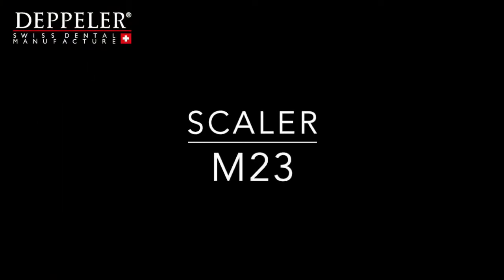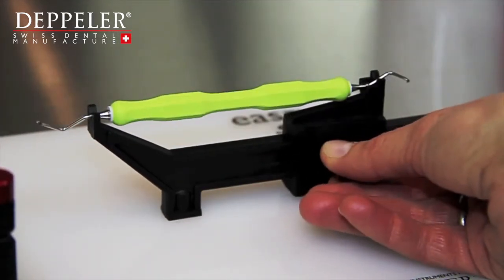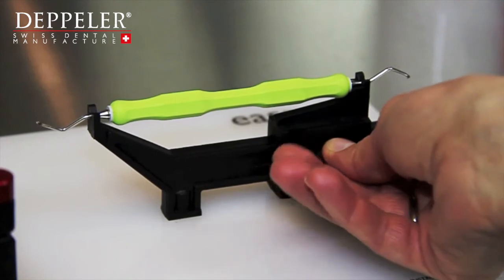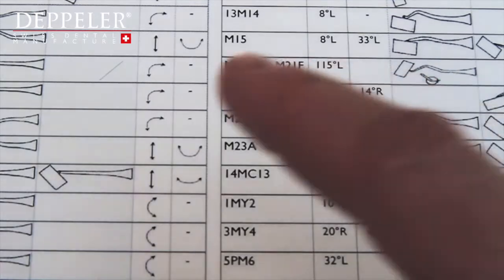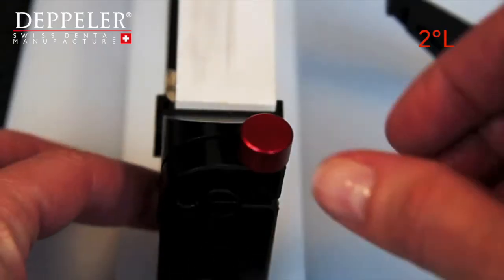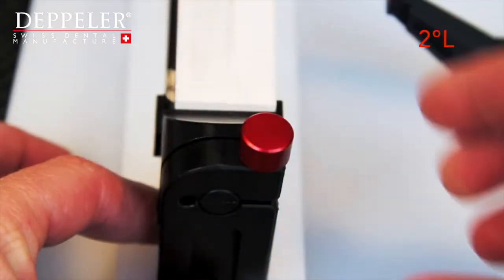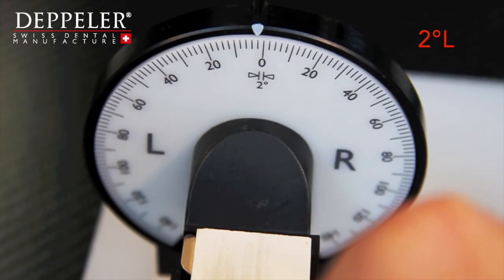Let's take the M23 universal scaler. Put the instrument on the support and adjust it according to its length. It must be able to turn on itself, but mustn't move back and forth. Look for the reference M23 on the list. The first angle is 2 degrees to the left.